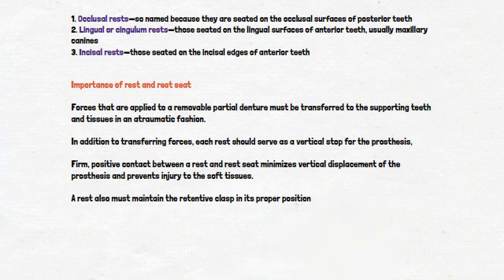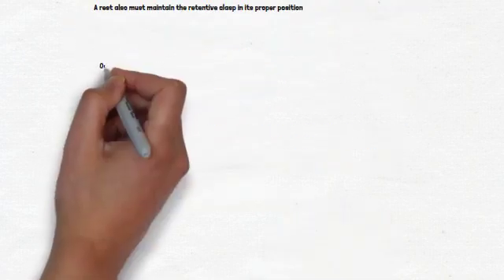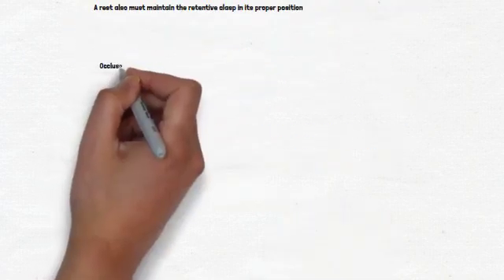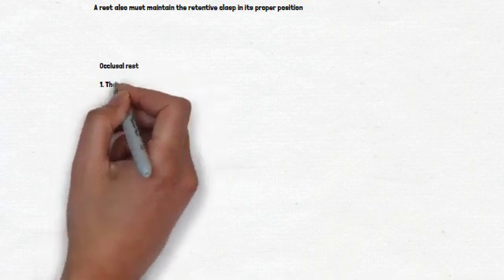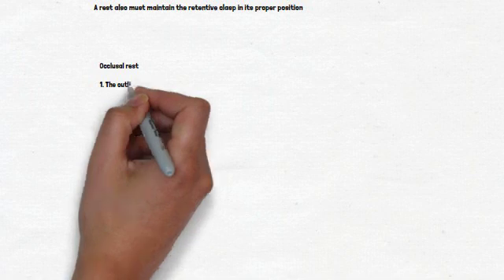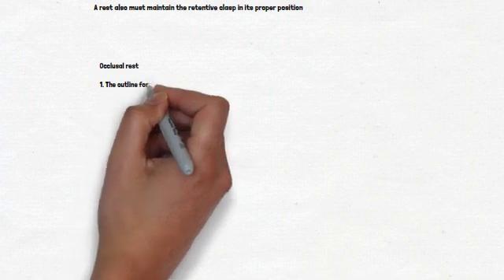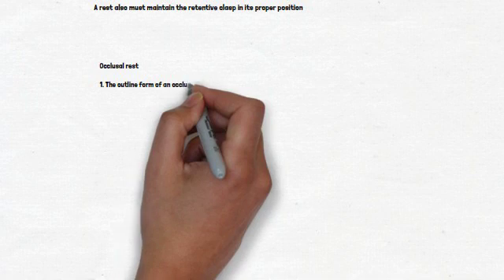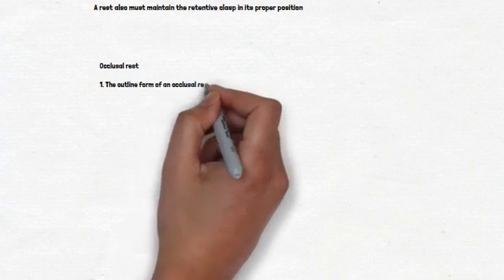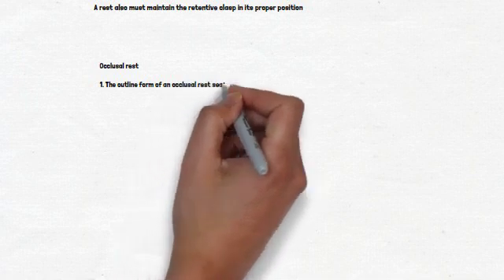Incisal rests. Incisal rests are placed at the incisal angles of anterior teeth and on prepared rest seats. Although this is the least desirable placement of a rest seat, incisal rests are used predominantly as auxiliary rests or as indirect retainers. Although the incisal rest may be used on a canine abutment in either arch, it is more applicable to the mandibular canine.